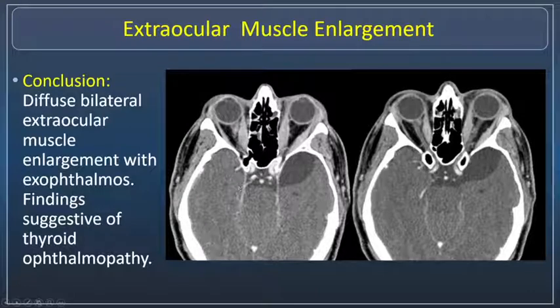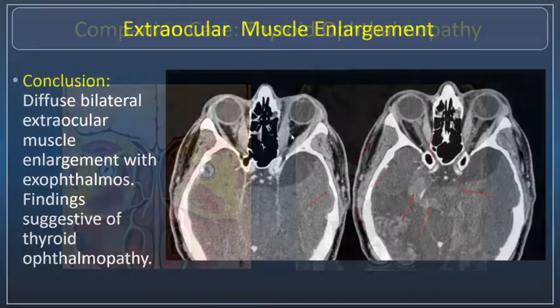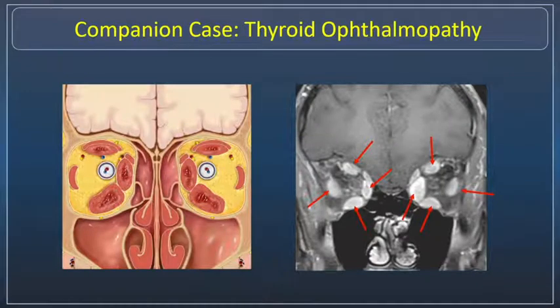And I think if we look at this, especially if we only take into consideration these two images here, you can see that there is indeed enlargement of the muscle bellies. This seems to taper so that the tendons do not appear to be involved. There doesn't appear to be significant nodularity or mass effect in the intraconal space, and not much stranding there. So I think that's a reasonable diagnosis, at least initially. Here is just a graphic illustrating that extraocular muscle enlargement that we spoke of earlier.